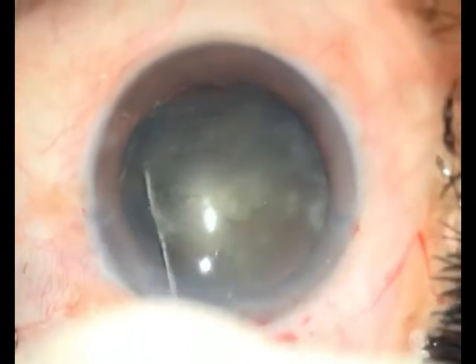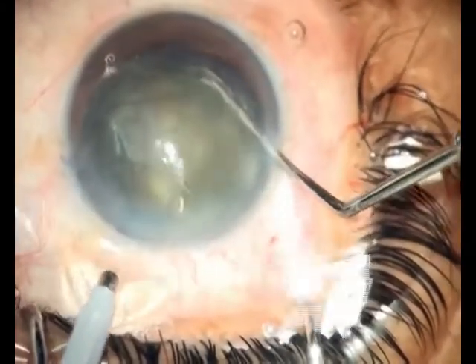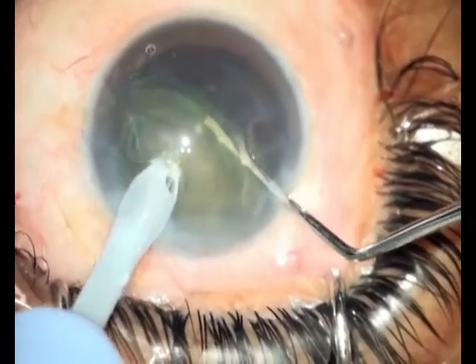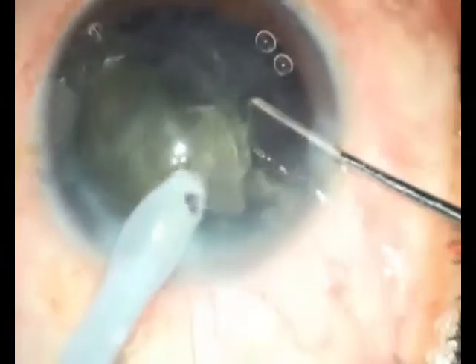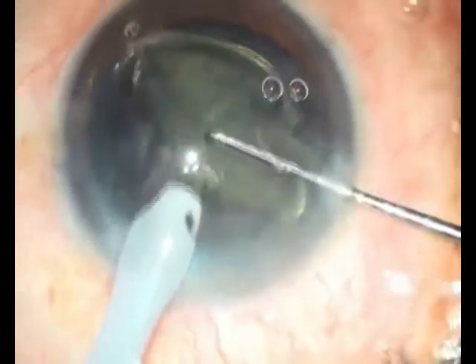While attempting a hydro prolapse, once the nucleus is prolapsed, after putting viscoelastic behind the nucleus, it's important to support the nucleus with a second instrument held behind the nucleus so that it prevents the nucleus from falling back. This aids in its easy and successful emulsification.